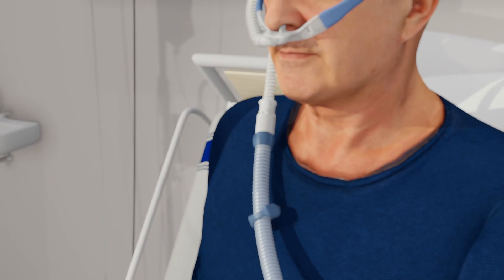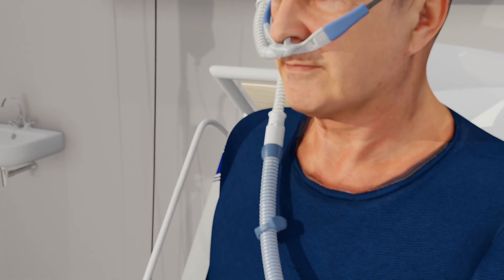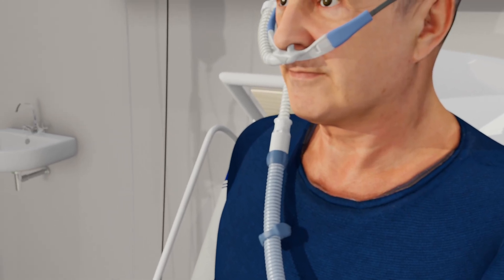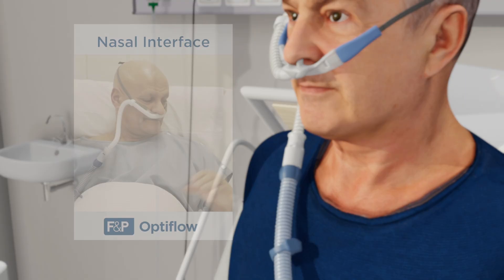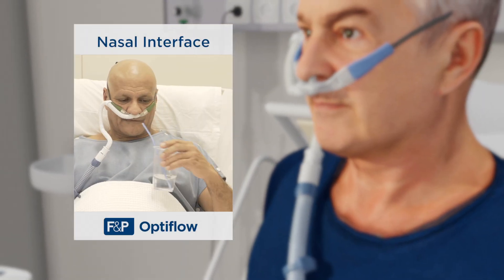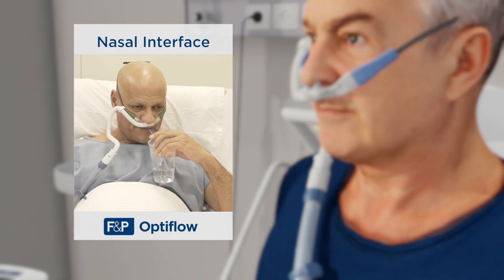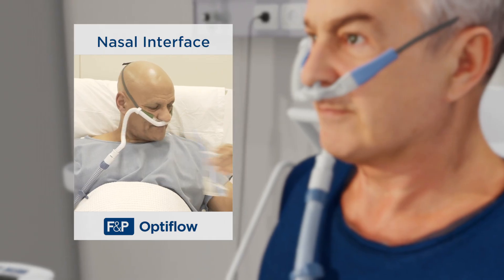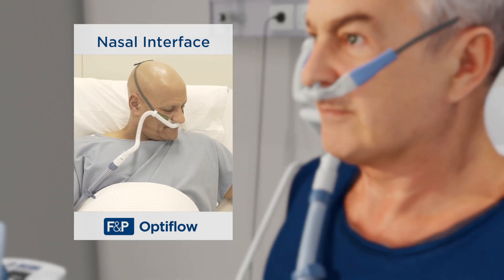The respiratory gas is delivered using an OptiFlow patient interface. If using the nasal cannula, the patient can eat, drink and talk during therapy, which may help patient comfort and compliance.